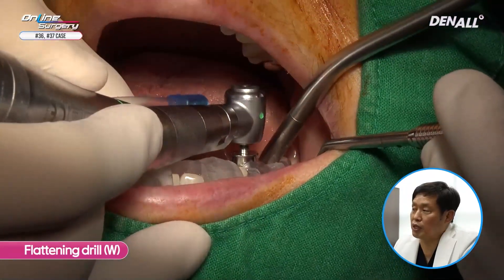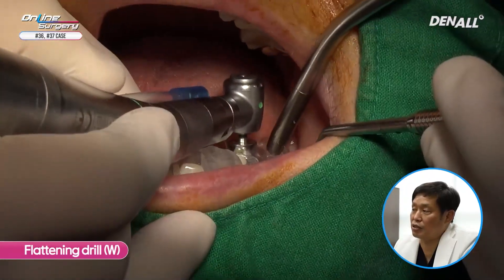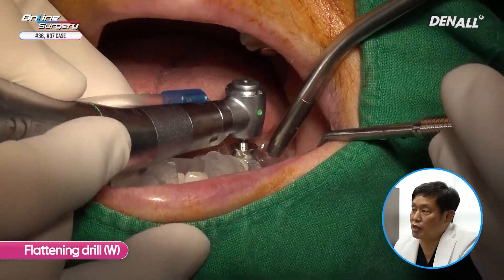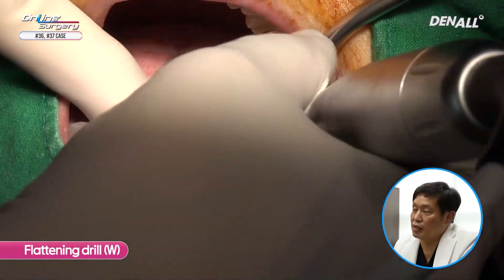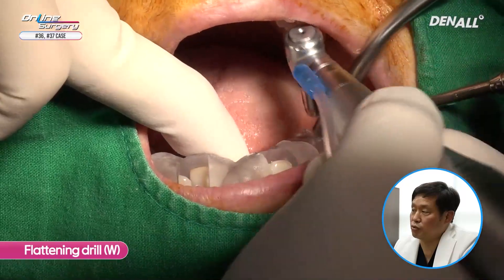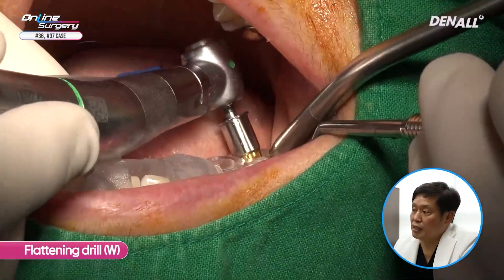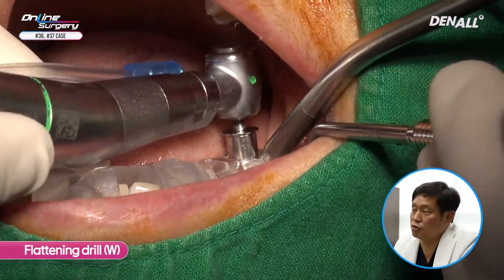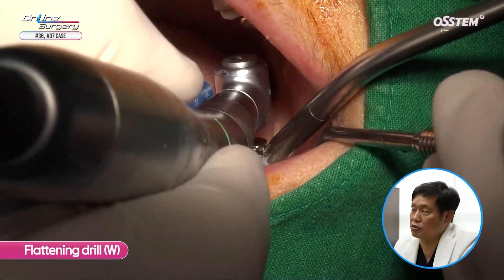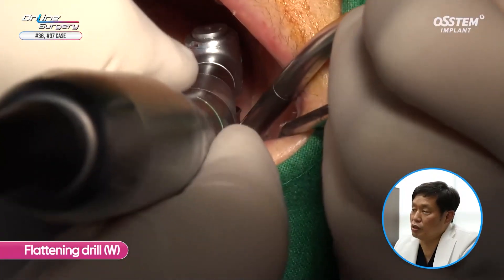A flattening drill is used to flatten the alveolar bone. I am going to place the implants a bit deeper. If you do not use a flattening drill, the initial drill may not go in fully, therefore the flattening drill is used to remove the superior structure. In number 37, the flattening drill is used full length to remove the alveolar bone slightly.